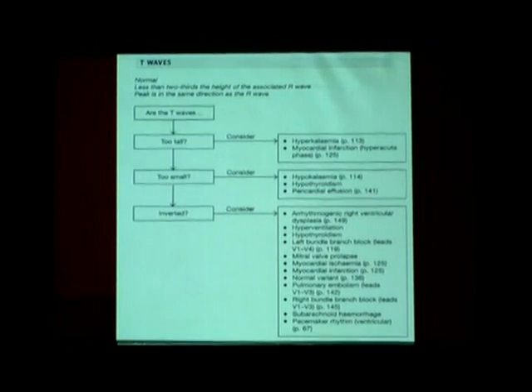Whereas if the QRS is normal, not wide, not tall, and has a well-formed ST segment with a symmetrical upslope and downslope of the T wave, symmetrical T wave inversion, it is ischemia. So it's the primary T wave change, which is ischemia. So the T wave can be tall, small, or inverted. What are the important differential diagnoses and how do you arrive at a particular diagnosis? So that's about the T wave, tall, small, inverted. That's all about the T wave, right?